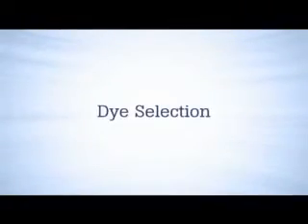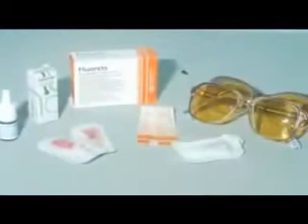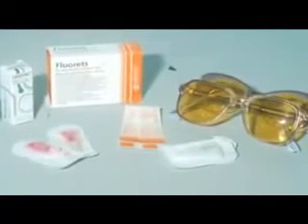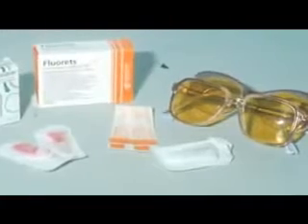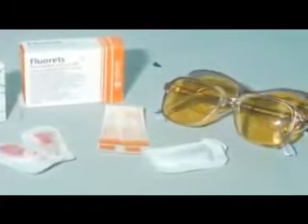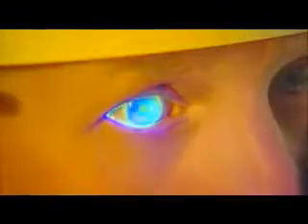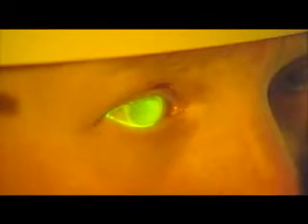Dye selection. For reasons of contrast and visibility of staining, it is common to use fluorescein to estimate surface damage to the cornea and lissamine green to estimate damage to the bulbar conjunctiva. However, when fluorescein is enhanced with a yellow barrier filter, such as Wratten number 12, fluorescein staining can be used to grade staining on both the cornea and the bulbar conjunctiva as well.